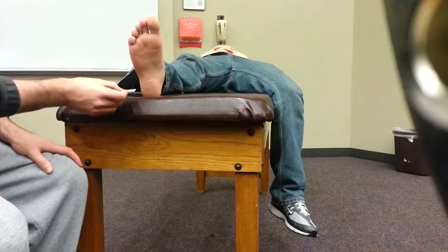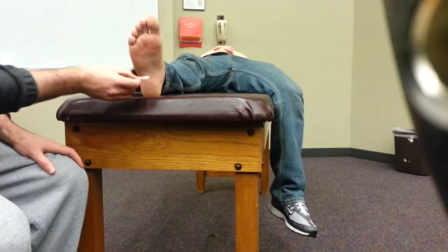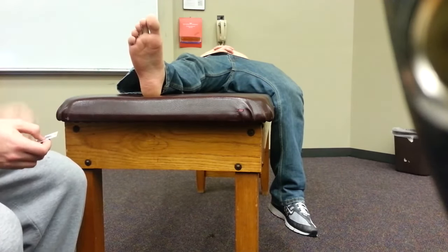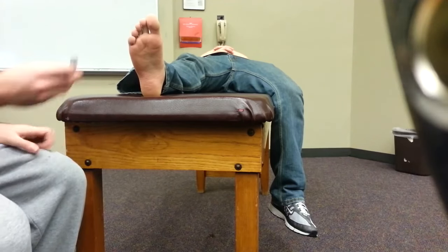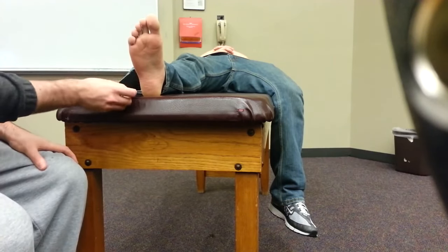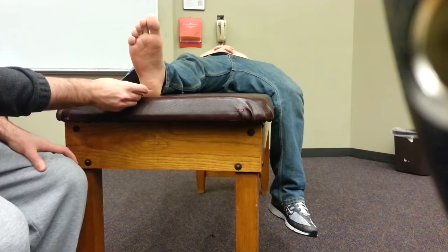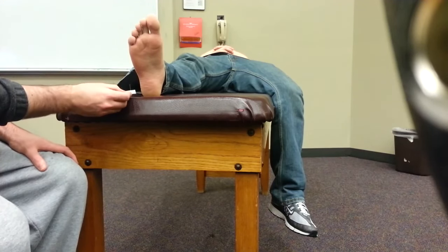You also want to make sure that you're not at a constant rate, because if the patient knows that you're at a constant rate, they can indicate that they feel it even when you're not even pushing. So you want to vary up your sites and vary up your speed. I'm going to assess the bottom of his foot, the plantar surface of his foot.